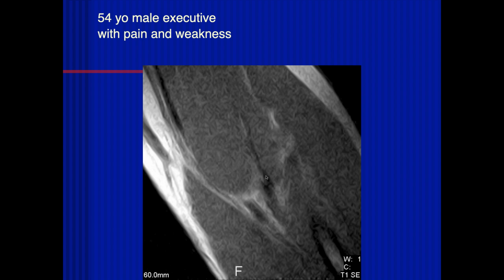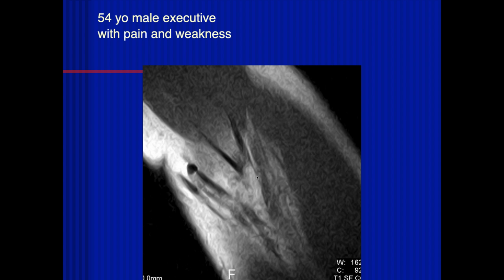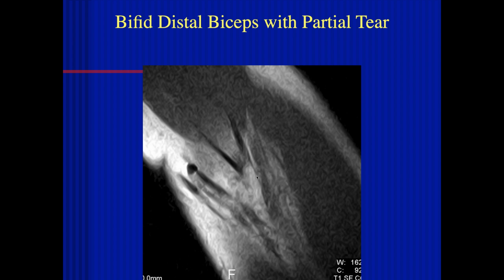Yeah, but be careful about the split. Here we can see in the coronal plane, it looks like there are two tendons there. Follow it down, follow it up. There are the two tendons. Those are the two tendons of the short and long head that are splitting. Okay. And so this actually was a bifid tendon all the way down to its attachment.